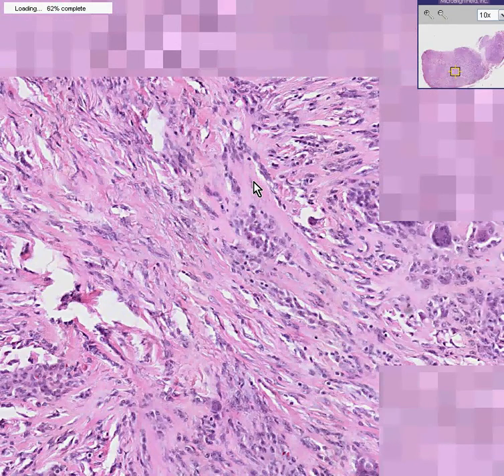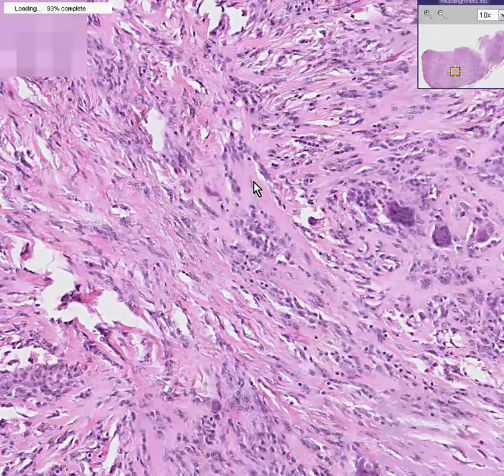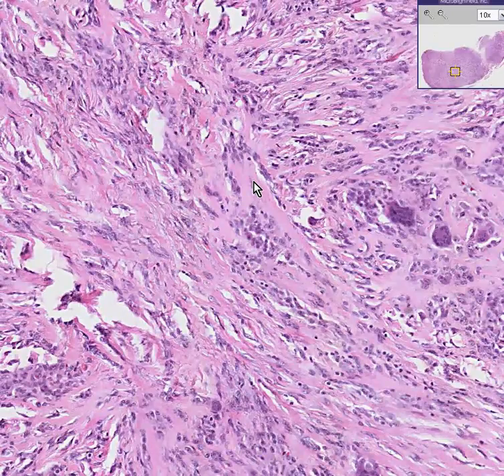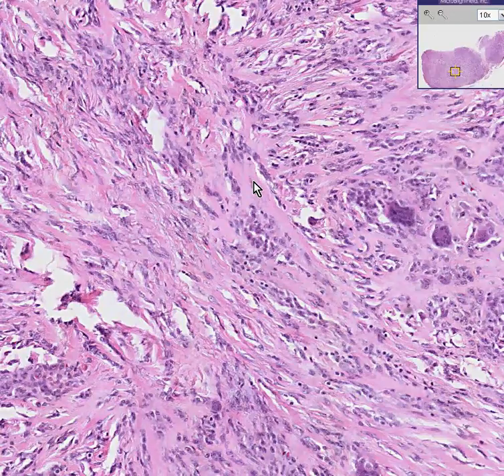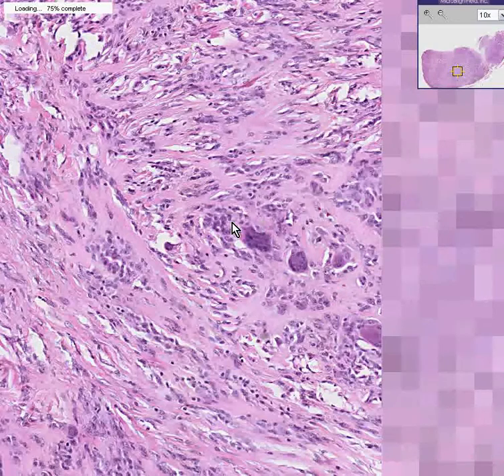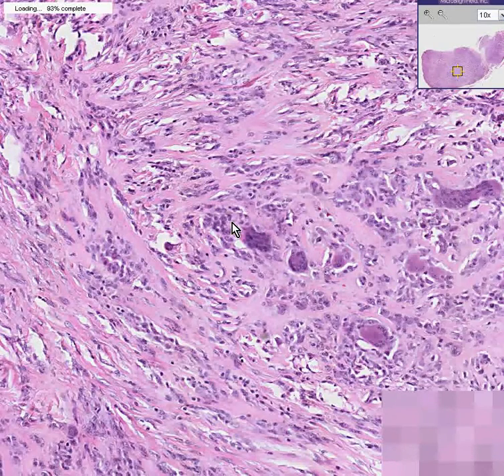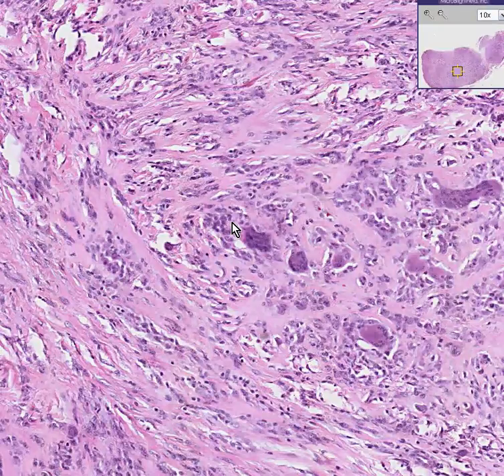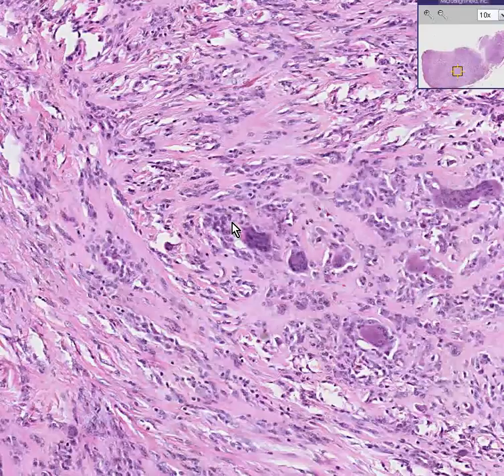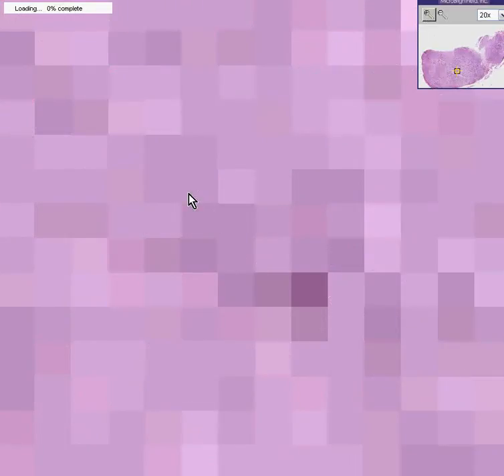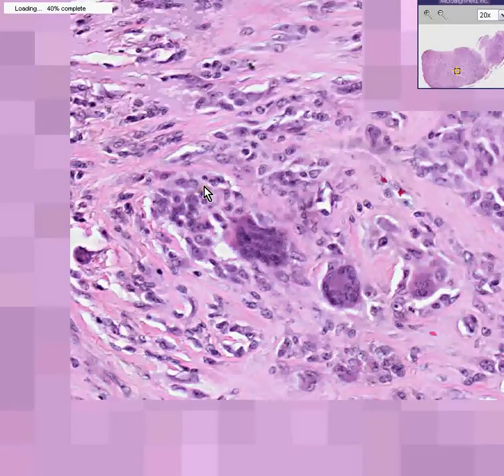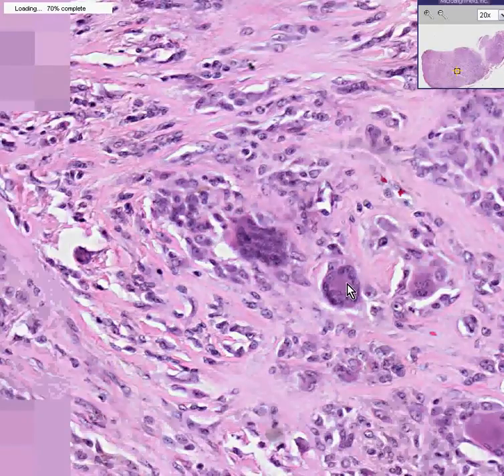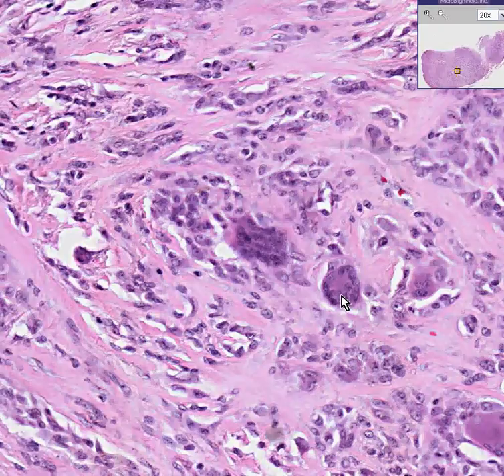This is a giant cell tumor of tendon sheath. The tendon is lined by synovial cells and there are a couple different kinds of synovial cells — they're not epithelial, they're not truly mesenchyme either. One of the main types of cell in a synovium is a cell related or derived directly from the macrophage or histiocyte line, which have the ability to form giant cells, and that's exactly what we're seeing here. We're seeing a tumor, a proliferation of synovial cells, some of which are forming these nice beautiful little multi-nucleated giant cells as well.